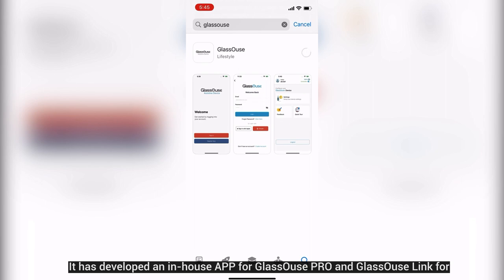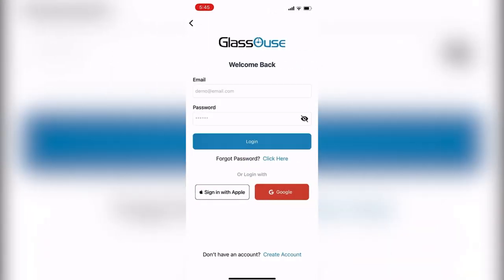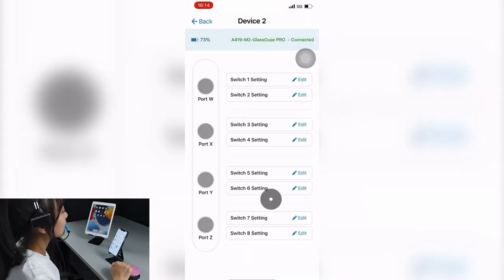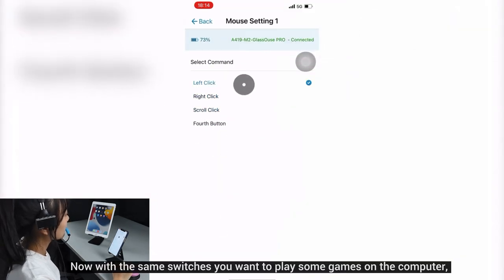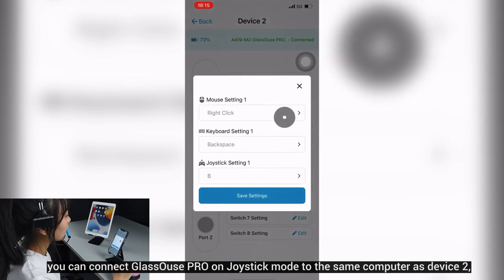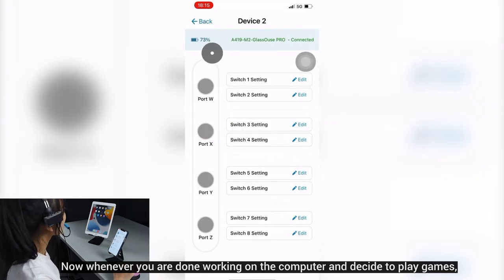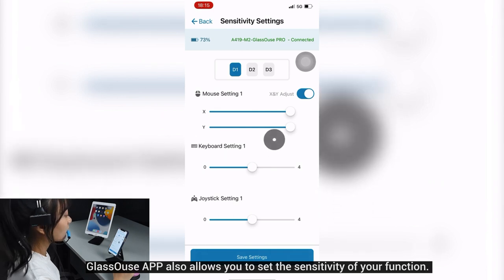GlassOuse PRO has an in-house app for users to assign assistive switch functions for each device and in each mode. For example, with two switches connected, you can assign them as left-click and right-click for your computer. With the same switches, connect GlassOuse PRO in joystick mode to the same computer as device 2, and assign the switches from the GlassOuse app as X and Y. Whenever you're done working and decide to play games, just switch GlassOuse PRO from wireless mouse to joystick mode. The GlassOuse app also allows you to set the sensitivity of your functions.